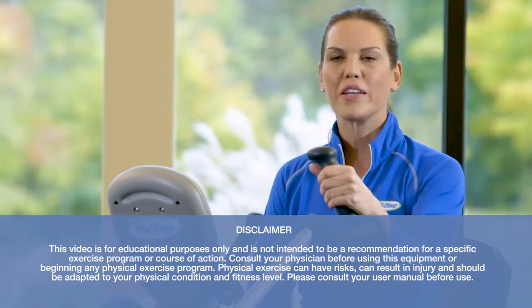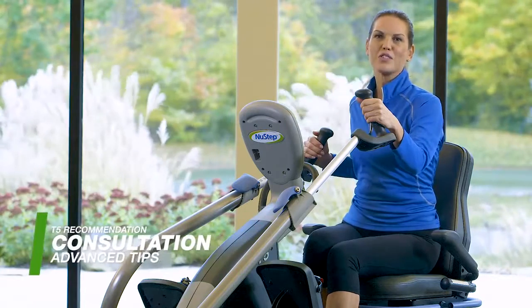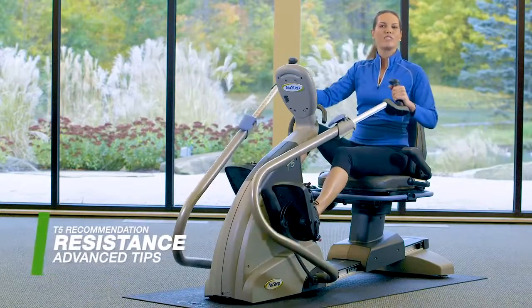Now you've got the basics done with the beginner video, let's look at more advanced options. As always, consult your doctor to make sure it's right for you. Let's start by taking advantage of resistance levels.